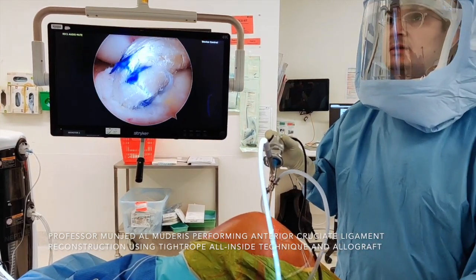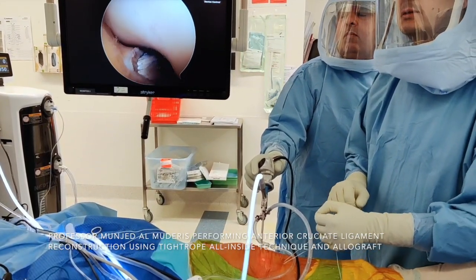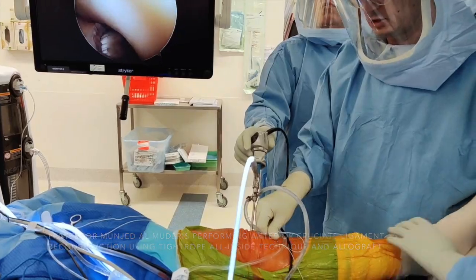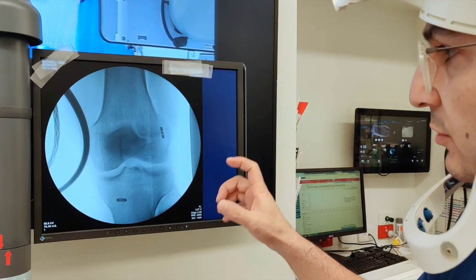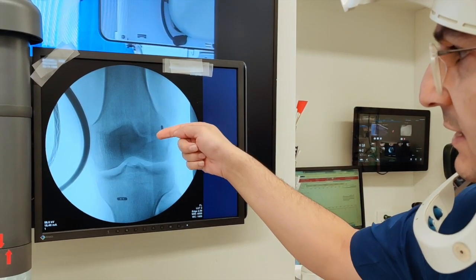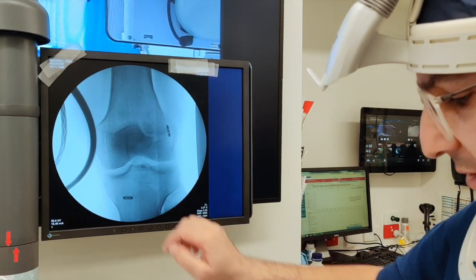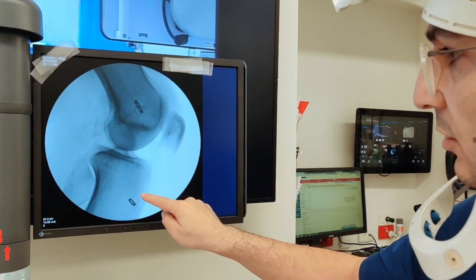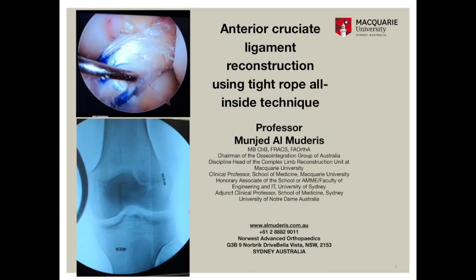The final step is checking the position of the graft and the tension — the position is very good and the tension is very good. I then extend the knee and perform the final tensioning of the graft in extension, making sure that the knee has full extension. Utilizing an image intensifier, we identify the position of the graft. You can see it's very horizontal, exactly where we want it to be. On the tibia, it's central on the AP view, and on the lateral view it's exactly where it should be. I'm very pleased with this position.